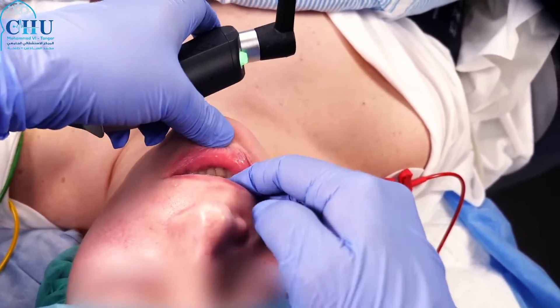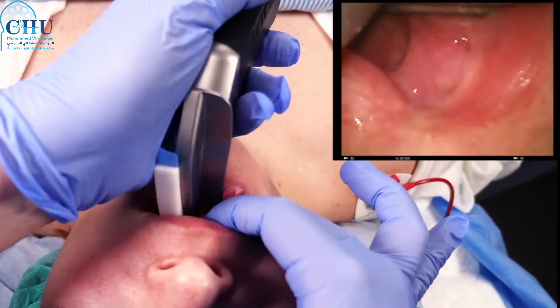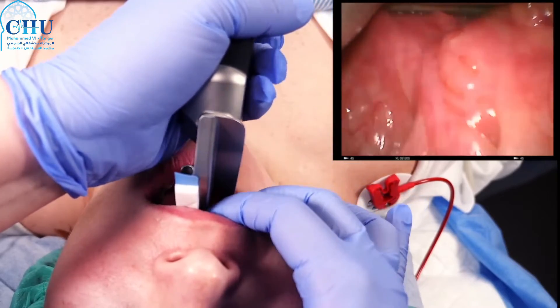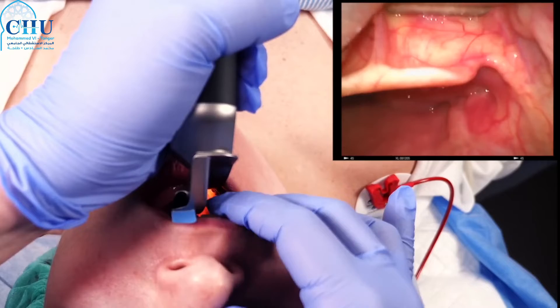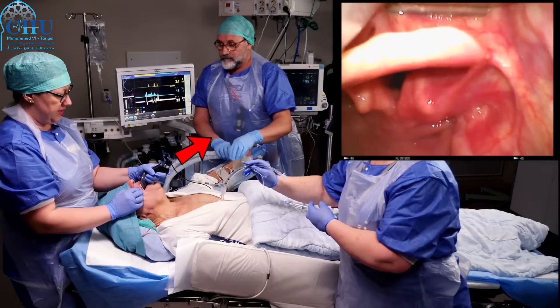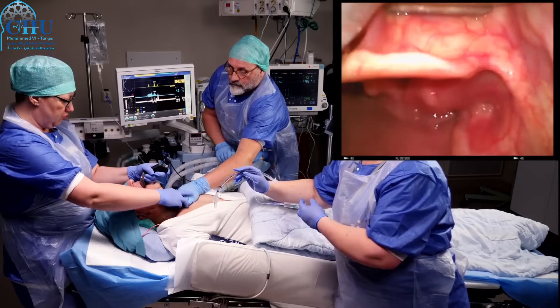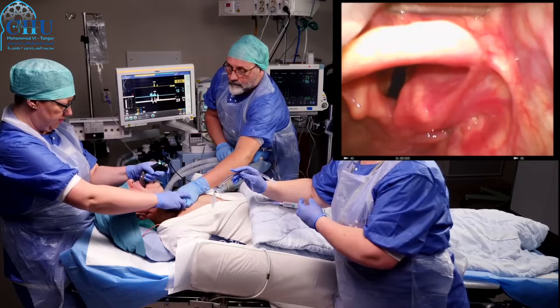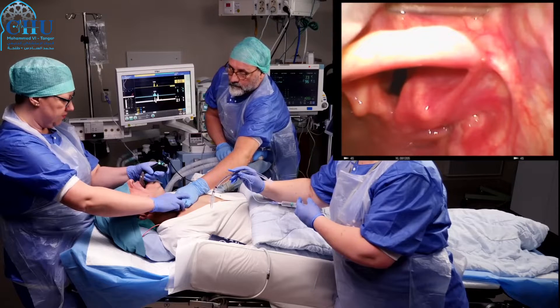Let's see the laryngoscopy once again. Advance the blade until you see the epiglottis and place the tip in the vallecula — the recess at the base of the tongue. At this point you can start to apply some force in the direction of the laryngoscope shaft. Sometimes a light external force on the larynx can make the vocal cords spring into view. Ask for your assistant's hand and move it to apply backwards, upwards, rightward pressure — or BURP for short.